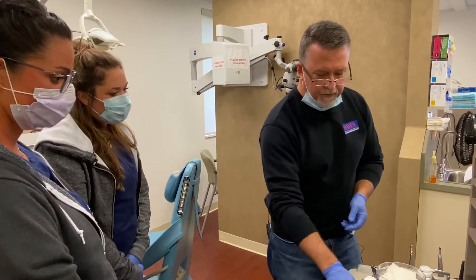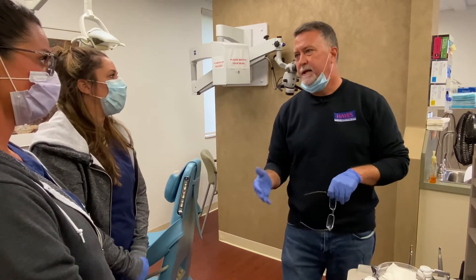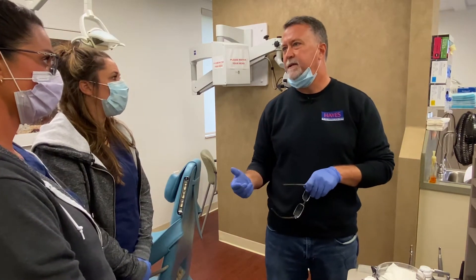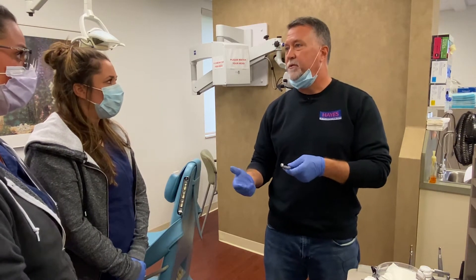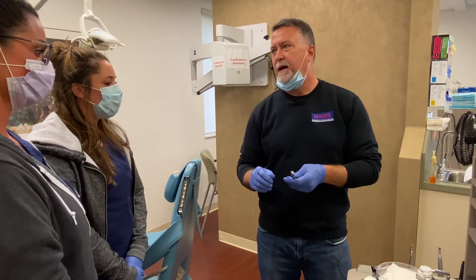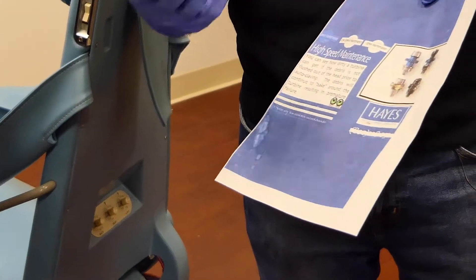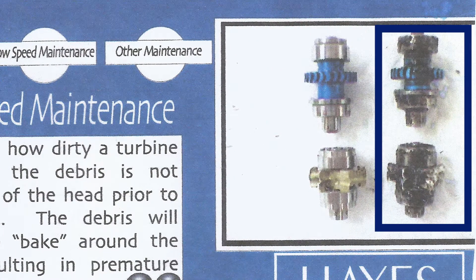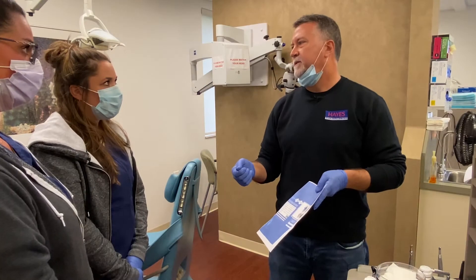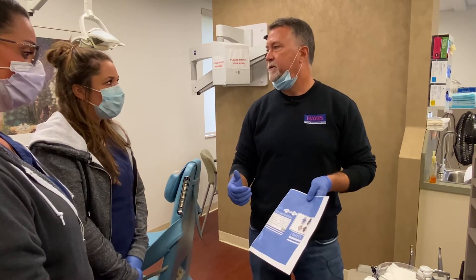One important thing to mention: when doctors run their handpieces and let off the foot pedal, it actually creates a suction back up into the head of the handpiece, pulling saliva and tooth particles up into the head. We want to expel that prior to autoclaving. If we autoclave the handpiece before expelling that debris, it gets baked onto the turbine itself. Over time that causes the bearings to break down — the doctor will notice no torque or a crazy high-pitched sound from the handpiece.